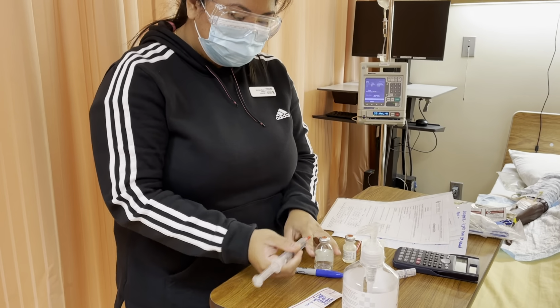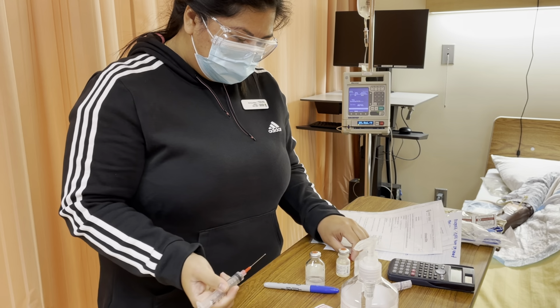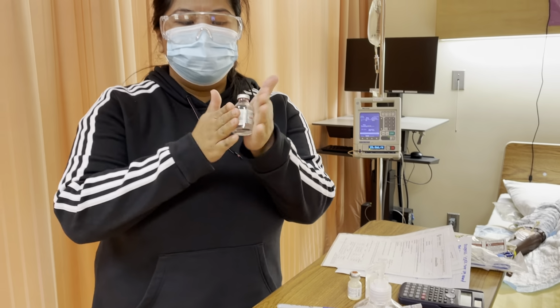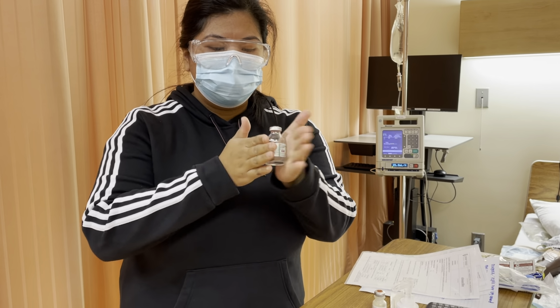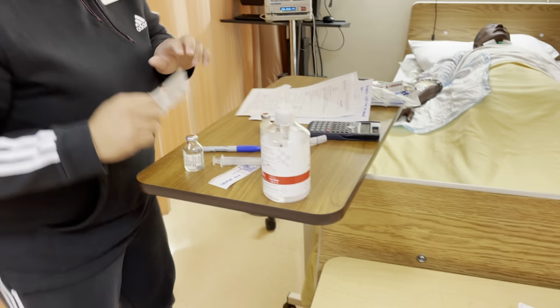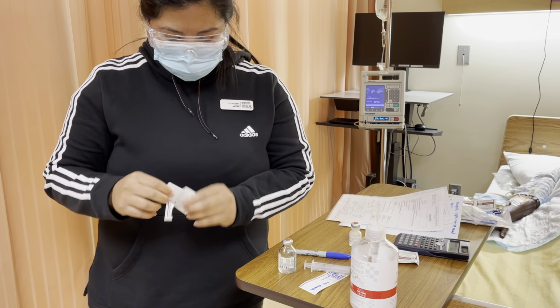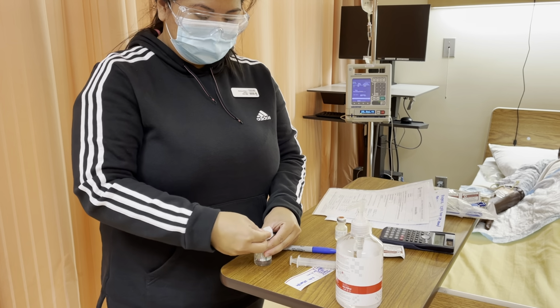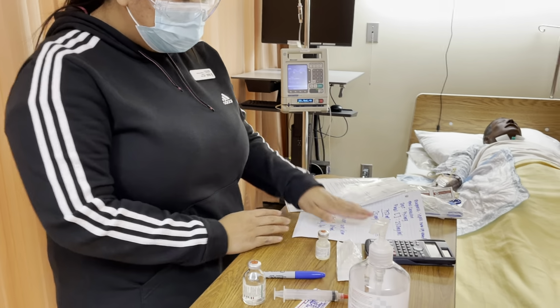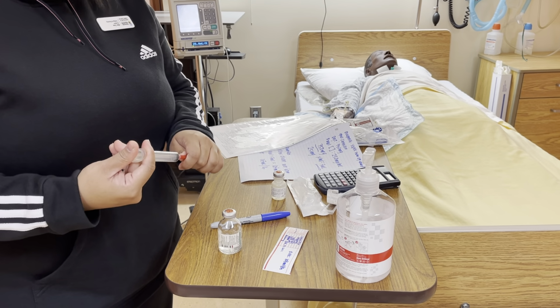We're going to inject that into our medication vial. We're going to roll the vial in between our palms to make sure all of the medication has dissolved. And then I'll swab it one more time just in case I accidentally touch the top. Now that I can see I don't have any air in my syringe, I'm going to pull that off. Based on my calculations, to get the 750 milligram, I need to obtain 3 ml of the medication.